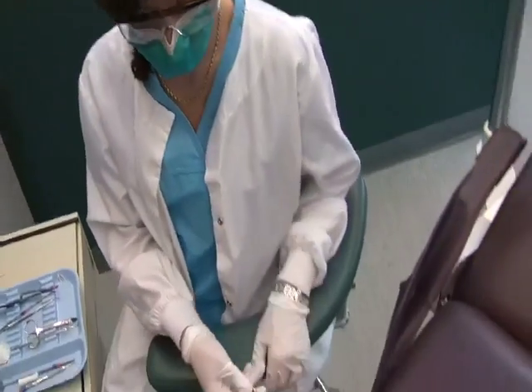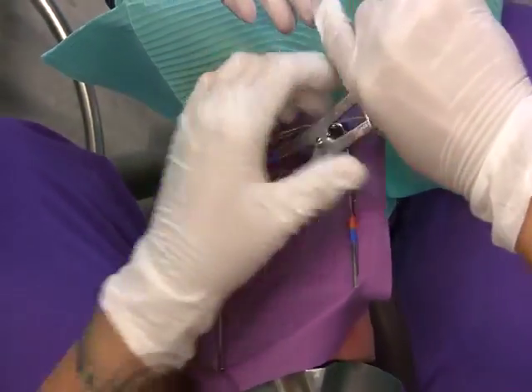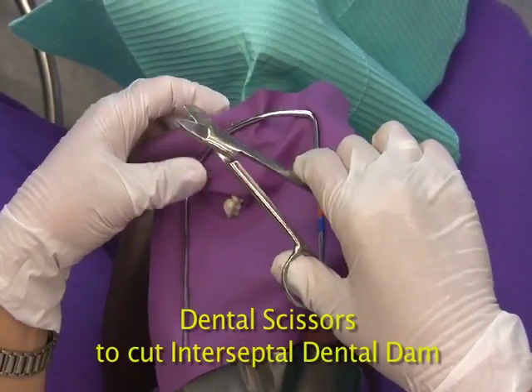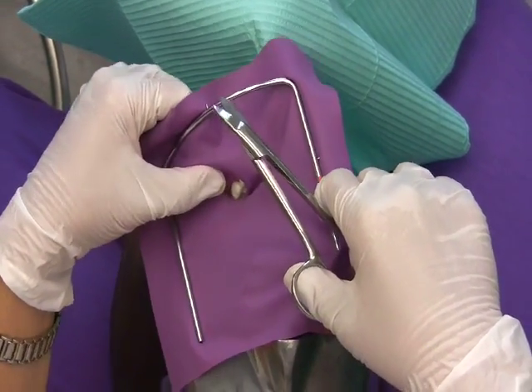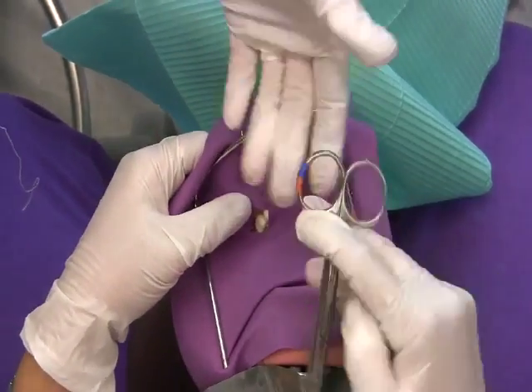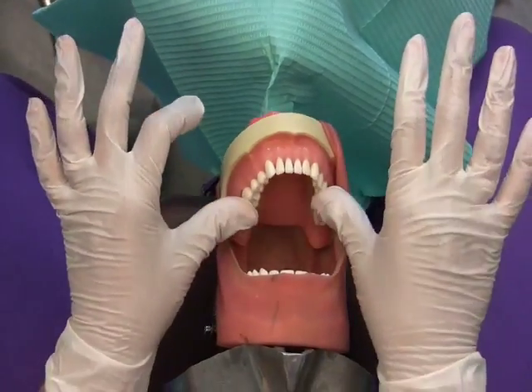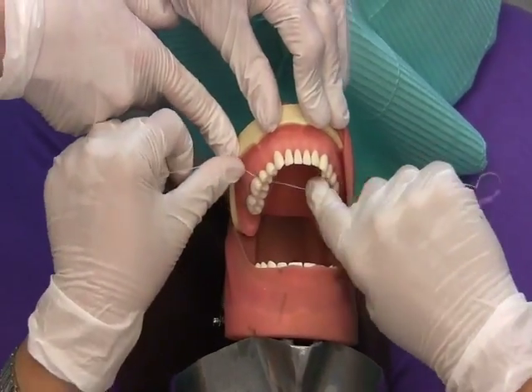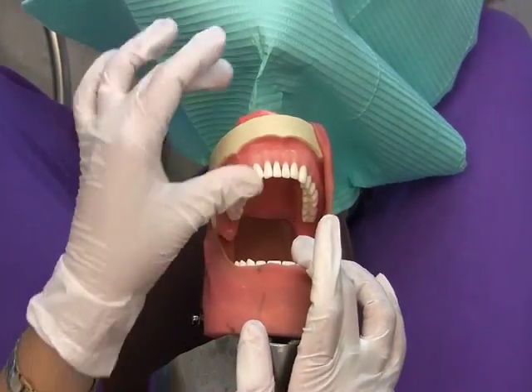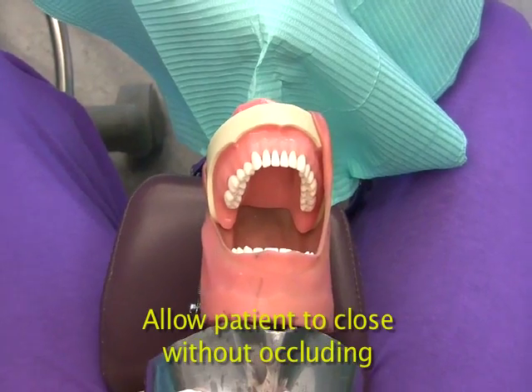Dental dam removal. Pass the dental forceps. Pass the scissors to cut the interproximal dam, stretch the dental dam, and check for any piece of dam missing. That's okay. Rinse and suction. Allow the patient to close without occluding.